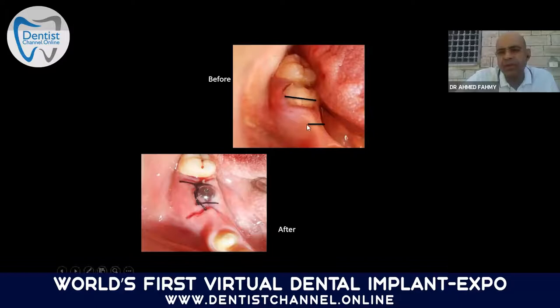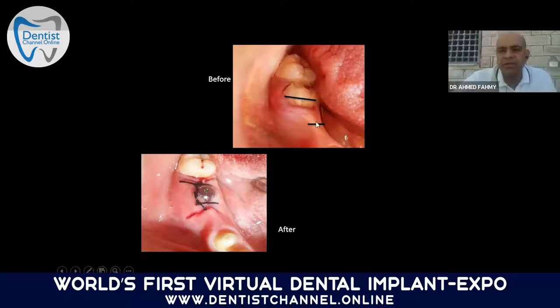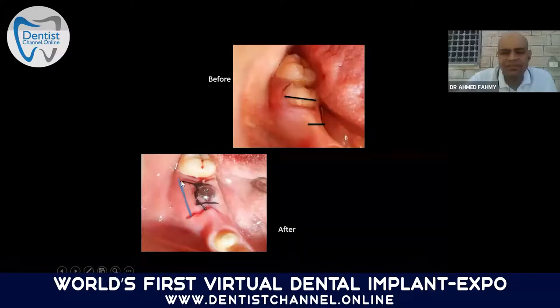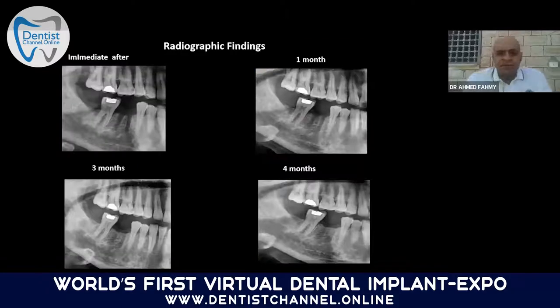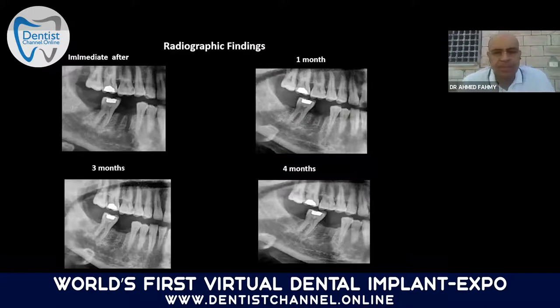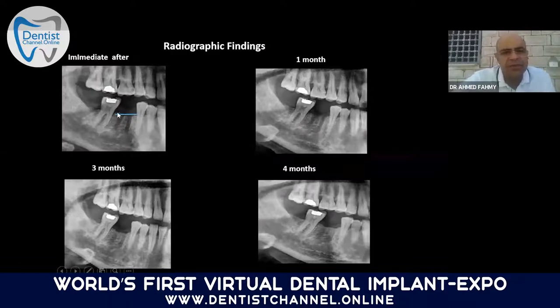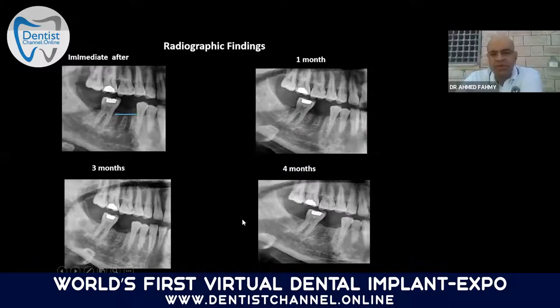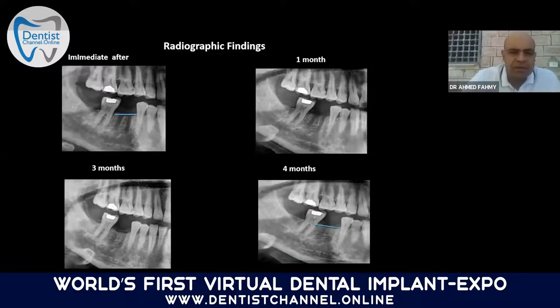We can compare in the same patient and on the same side: this is the first molar area with extraction and normal socket healing without preservation — you can see the bone collapsed. With PRF socket preservation, the bone is maintained. Even in panoramic radiographic follow-up, from immediately after extraction to one month, two months, and four months, it looks very nice with no significant changes.